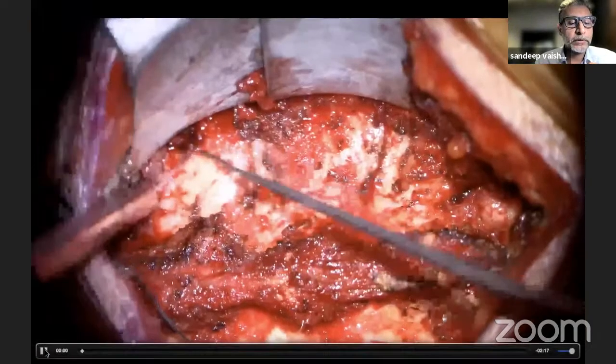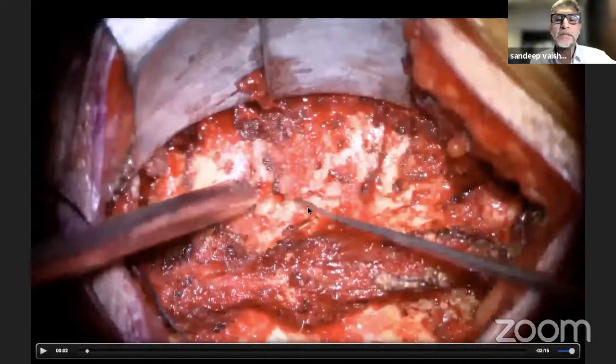So I'll show a short video about the procedure. I'll just show the anatomy here. This is the cranial part where my arrow is. This is the caudal. This is midline. You can see the spinous processes here. This is lateral. And this is the right side of the spinal canal, which is exposed. This is the right lateral mass. And as you can see here, this is the lamina, and this dissector is placed at the junction of the lamina and the lateral mass.